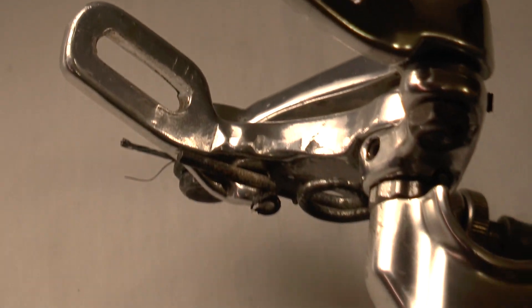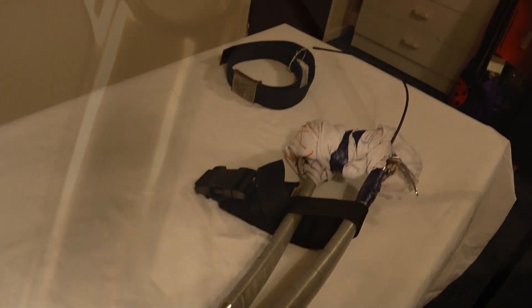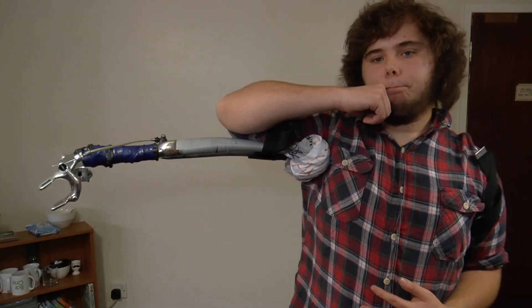Is this the finished product? No, not by any means, and this is a very important point and the one that I hope you take away from this presentation. A grand total of 2 hours have been spent on my own in my kitchen designing this prosthetic. I am by no means a guru with bikes and have very little mechanical engineering experience.